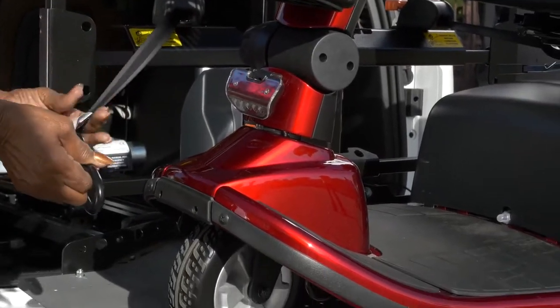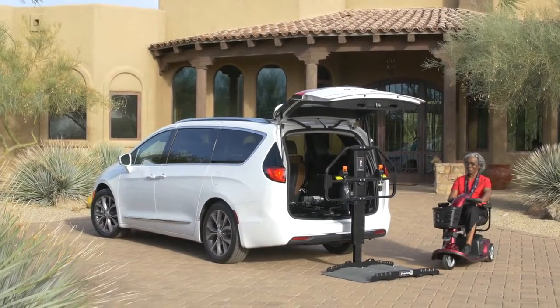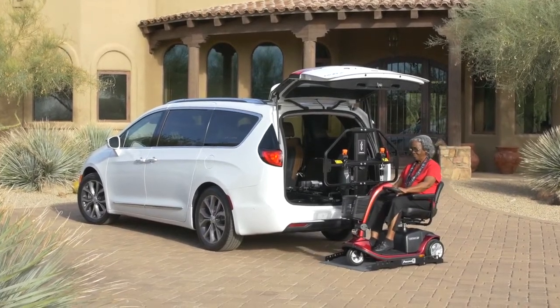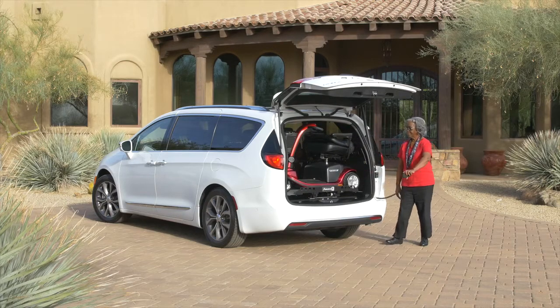If you'd like even more peace of mind, optional securement belts can be added to the barrier. There's no need to make any modifications to your scooter or power chair when using a Joey — just drive up, push a button, and your mobility device is neatly stowed inside your vehicle and away from the weather elements.